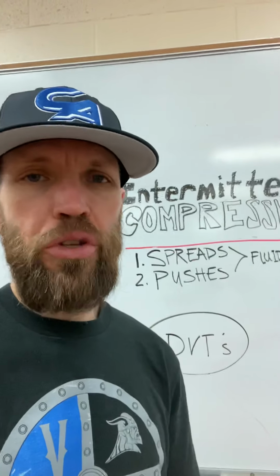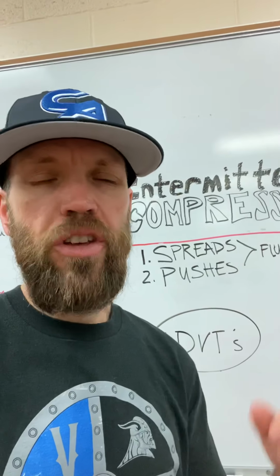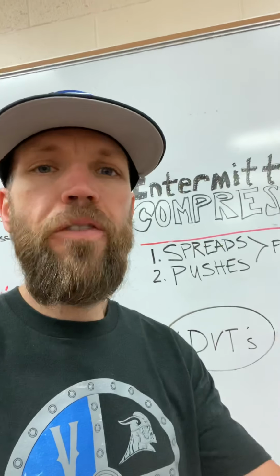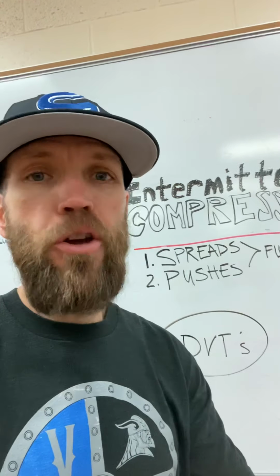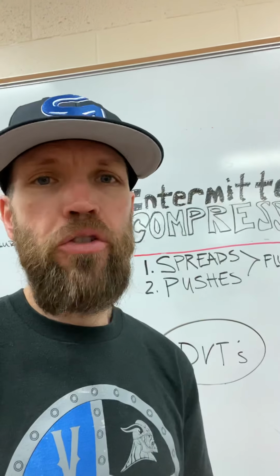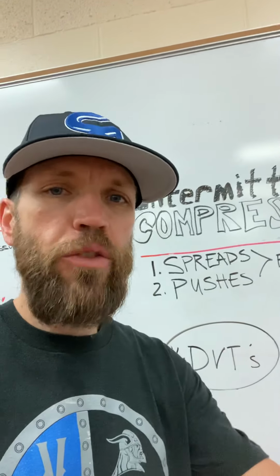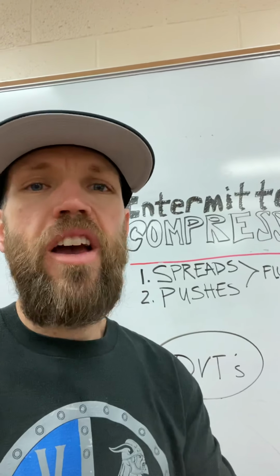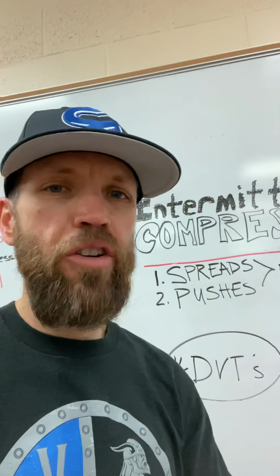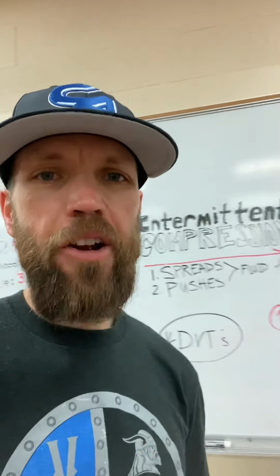And it's a great tool to use, because if it's applied pretty much at the time of hospitalization or post-surgically, then what it does is it helps to mechanically move fluid from a high pressure area, which it becomes once we introduce the compression, to a lower pressure area. And so if we're pushing fluid upwards, we're removing it, and that gives space for that good, healthy blood with all that good nutrition to come in there and circulate and do what it's supposed to do anyways. So let's talk about our tool for just a minute.